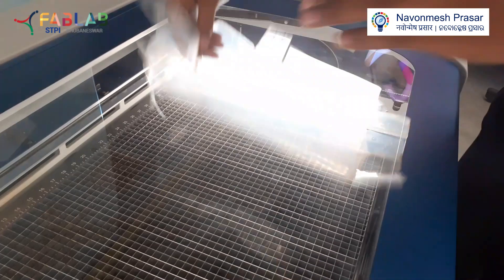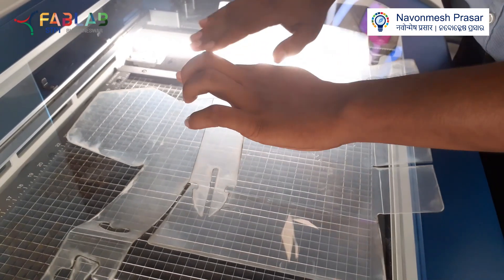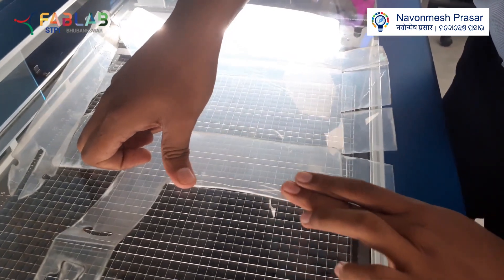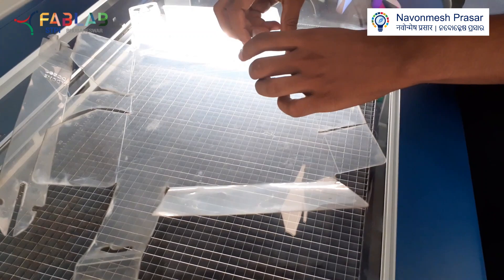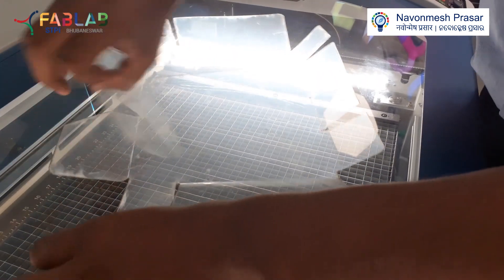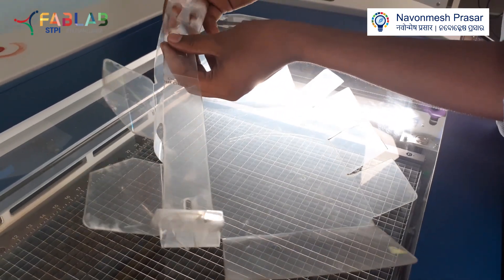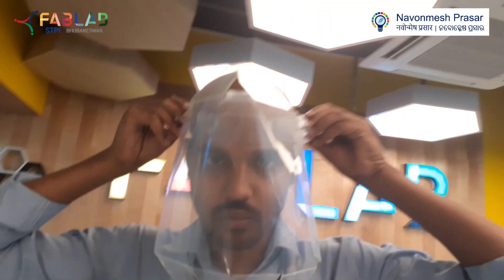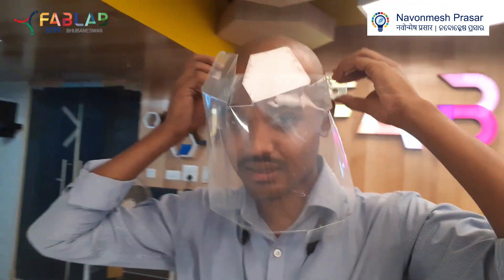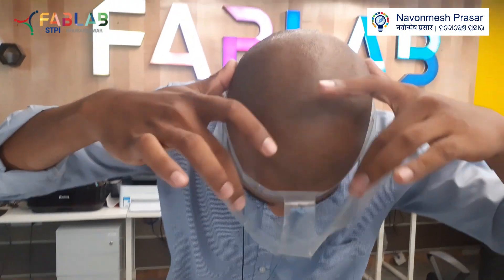then you have to make turns to hold this — these two flaps, this flap and this flap — and then you need to connect it like this, and you need to wear it like this. You can connect this with elastic or anything. The best part of the shield is you will be getting a clear space between this shield and your face.